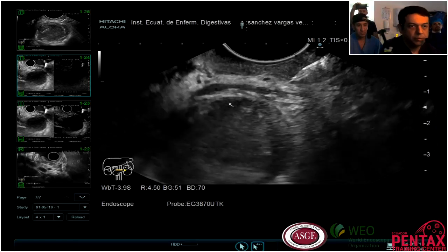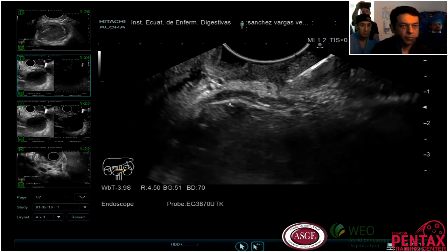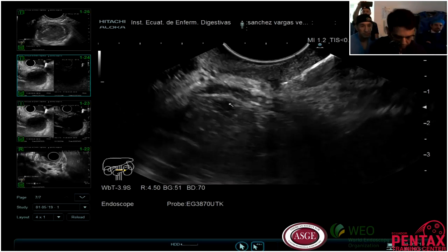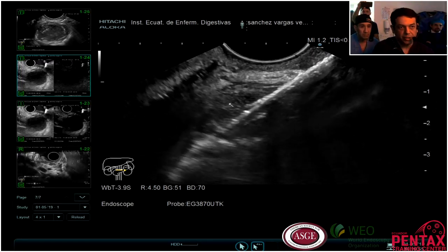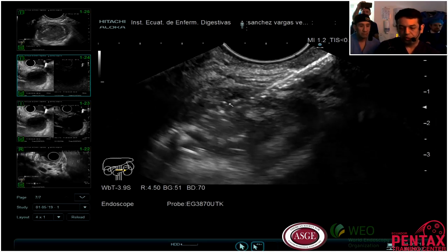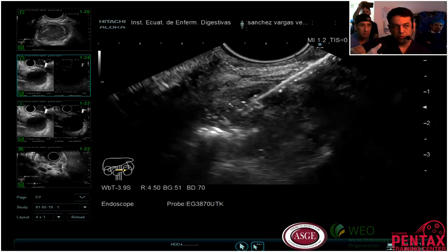I will push a little bit. I am inside, you can see. So I will put my finger here just to be sure. I am sure that I am inside. So I will start to open the distal.